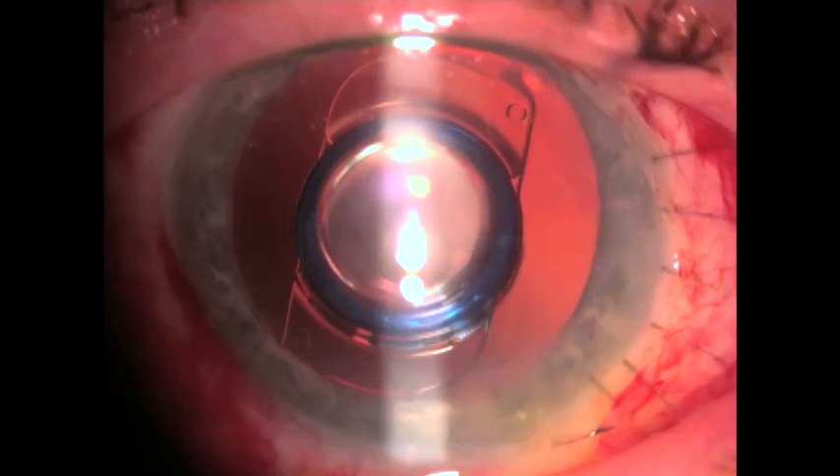Here on the first postoperative day, the cornea is noted to be clear, the telescope device well centered, and the eye quiet.